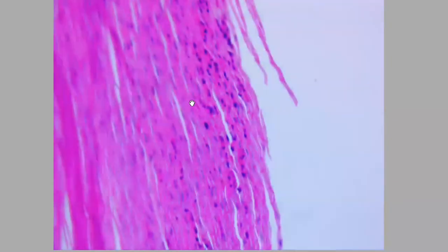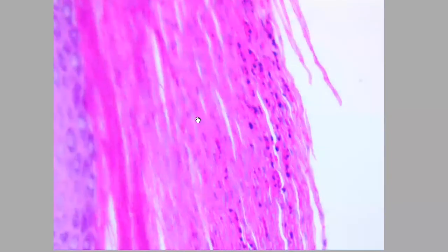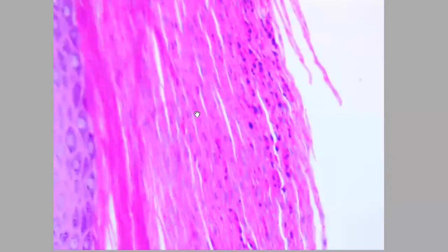I moved here directly to the 40x so as not to make it long. And here we can see the parakeratosis, these small blue dots, which are the retained nuclei. And we can see here these big ones, they are the neutrophils present on top.